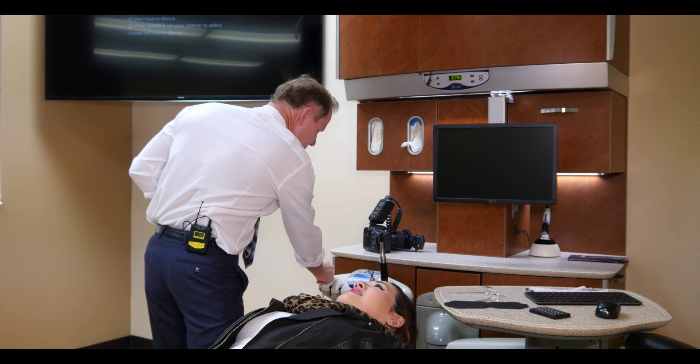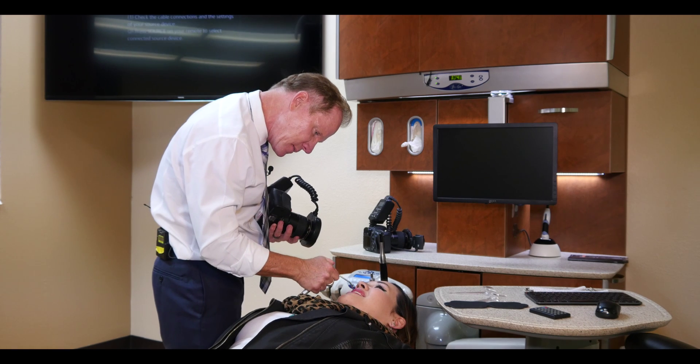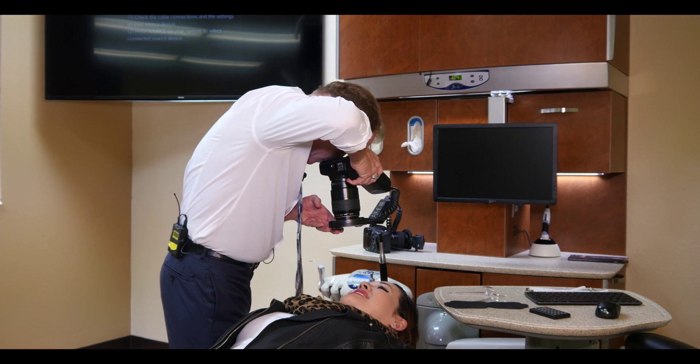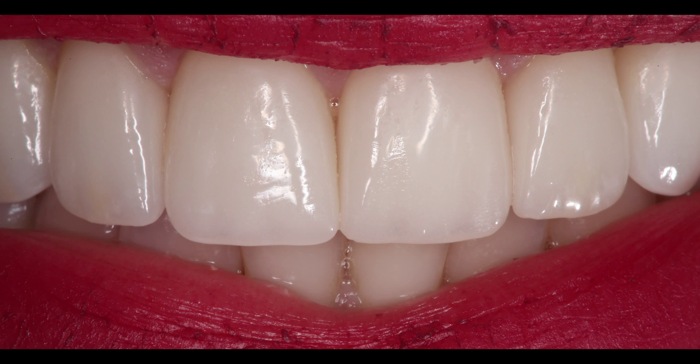If she has some saliva bubbles, just use the air-water syringe — your assistant can do this. A little bit of air — don't let it startle you. Big smile. Blowing air and getting rid of those saliva bubbles or anything between the teeth gives you a more professional image, so we're not photoshopping it out later.